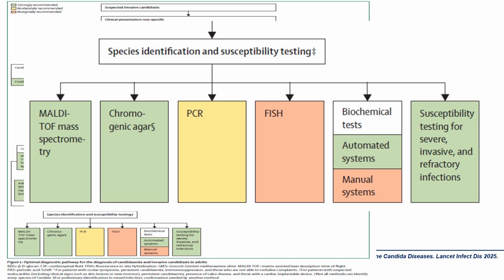And if you look at PNA FISH, from positive blood cultures it is recommended with marginal support only, and only as commercial kits are currently available.